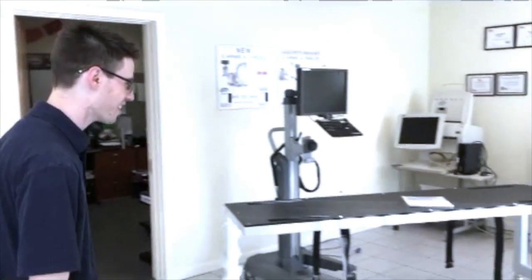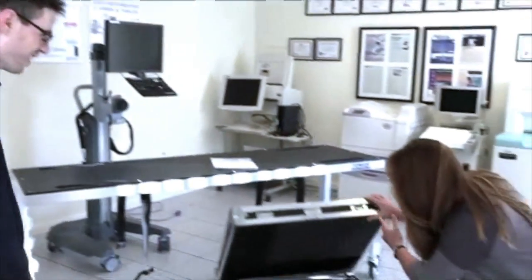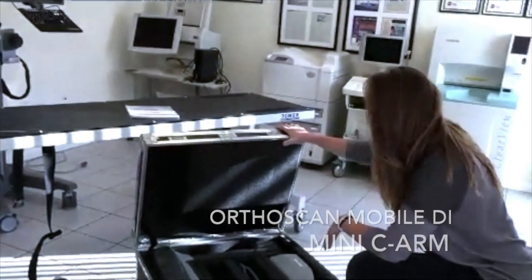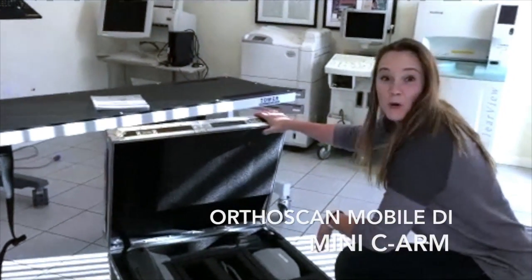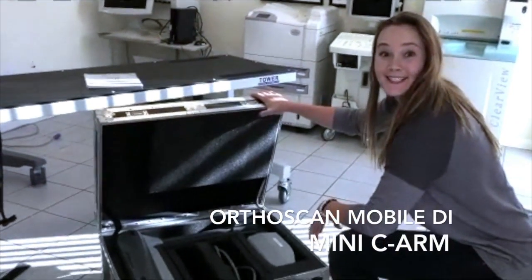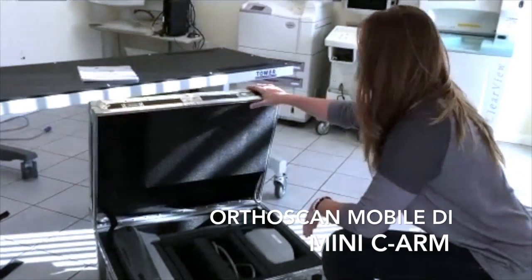Hi, my name is Andrew and this is Integrity Medical Systems. Today we just got a new package. What do we get today Chelsea? Whoa, we got an Orthoscan Mobile DI Mini C-Arm.